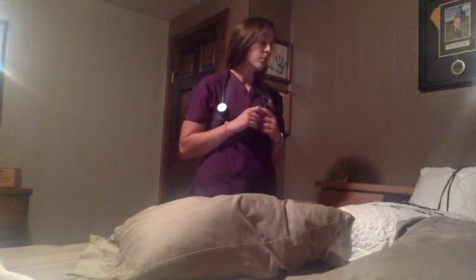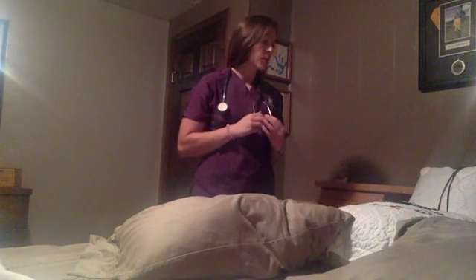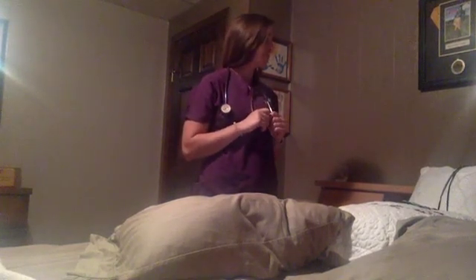For care of the NG tube, make sure that I flush and irrigate every 4 to 6 hours, and make sure that it's still patent by flushing. Then check that no meds go down the NG tube, such as enteric-coated medications. Yeah, and just keep him NPO. We'd have TPN or enteral feedings going, and make sure I check glucose. And then, yeah, just keep him NPO. So, that's it.